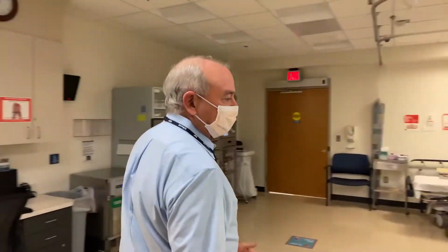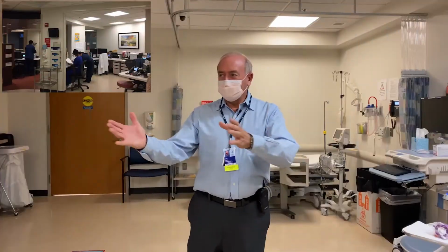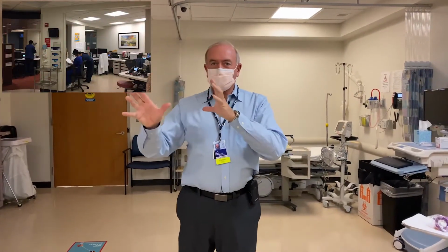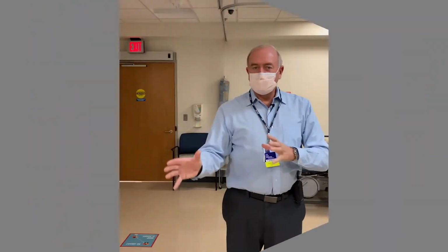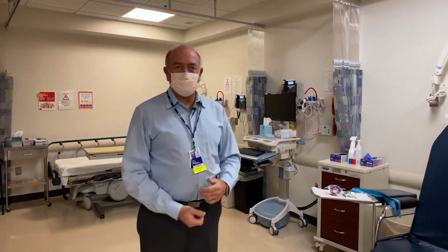Now that we've seen the basics of how a CT works, we'll walk into the IV area, where we just walked through the CT waiting area. After the general waiting area, you saw the fishbowl here, which is the center of control, and is where we place the IVs in the patients before they have their CT for the IV contrast.